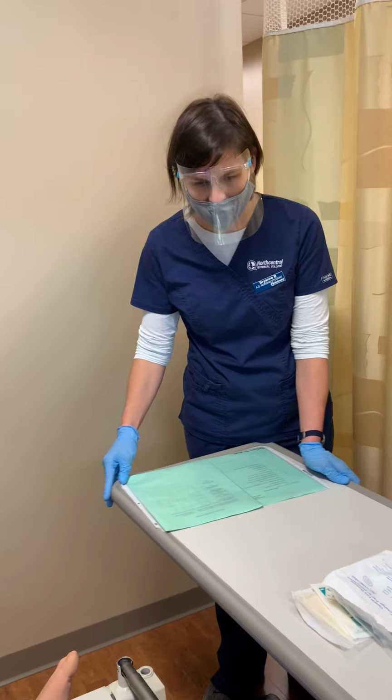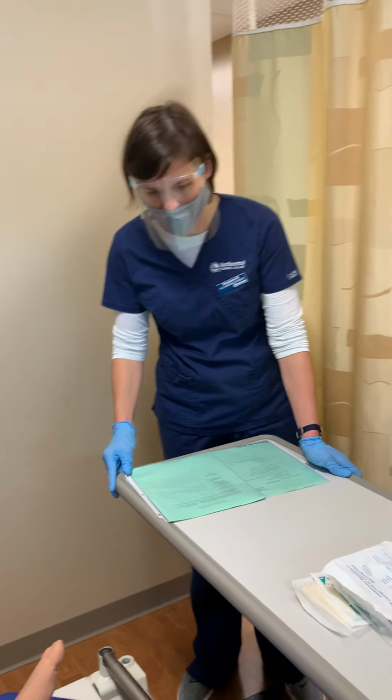So I can bring my table into the room. I just want to switch sides. Yep. A little further here. All right, Francis, the last thing we want to work on right now is getting your central line dressing changed. It's peeling up a little bit here, so I'm going to get a fresh one on for you.